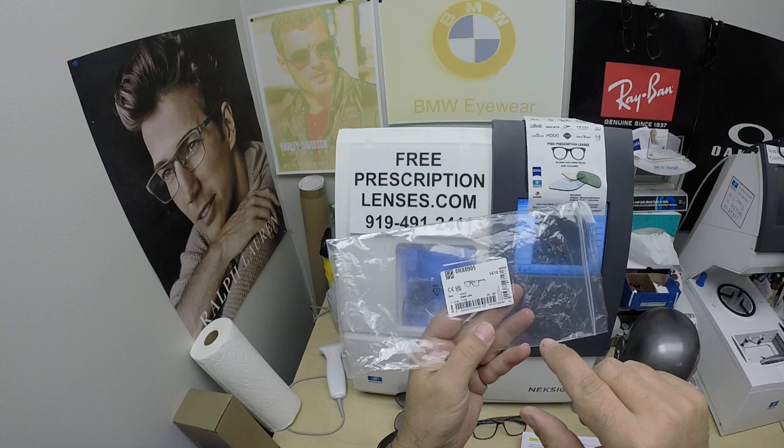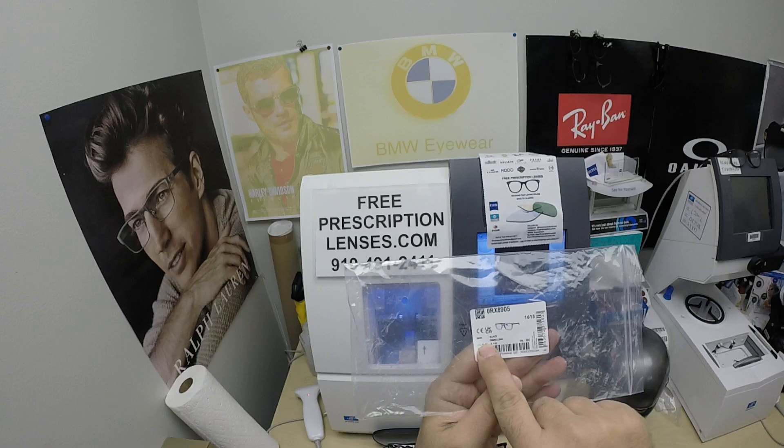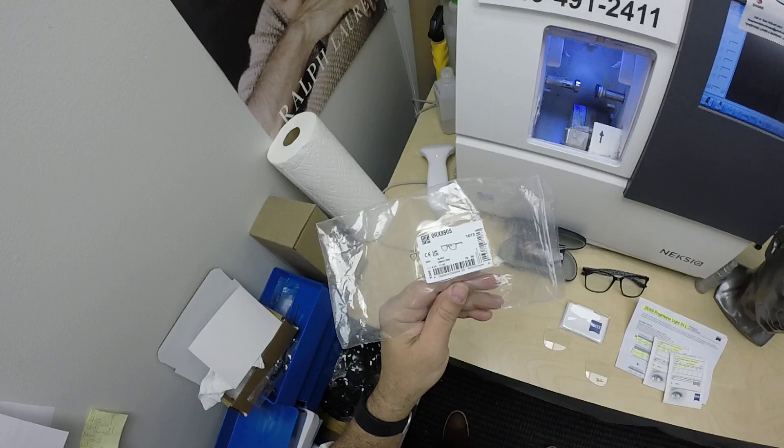Now it comes in three colors: black, a transparent blue, transparent gray. It comes in two sizes, a 55 and 53. Mark's getting the size 55 in color 5843, which is the black.